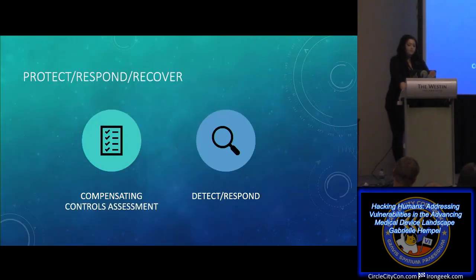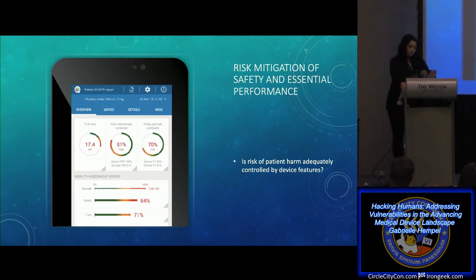Implementing device-based features to mitigate risk of harm, performing compensating controls assessments, and detecting and responding to any suspected vulnerabilities as soon as they appear. We also want to ensure that the risk of patient harm is adequately controlled by device features.